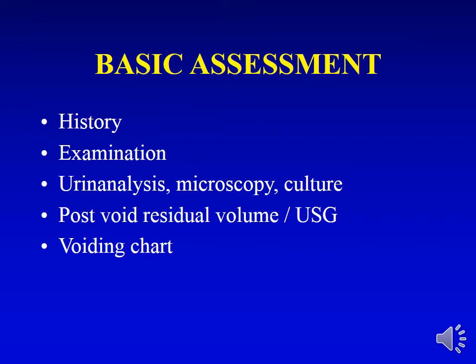We need to reproduce the same symptoms the patient has to make a proper conclusion of the urodynamic diagnosis. So history: we need to know exactly what the symptoms are, if there's any leaking of urine, how much leaks, when does it leak, when the patient is performing an activity and starts leaking, and whether she's had a neurological injury before.